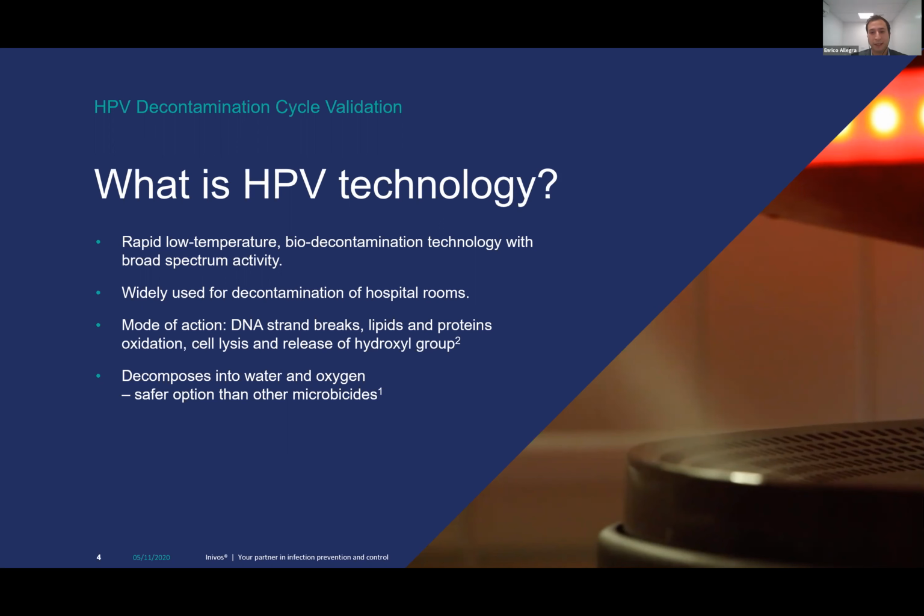I guess a good place to start will be to talk about what is hydrogen peroxide vapor technology. We know that hydrogen peroxide vapor is a relatively rapid biodecontamination technology, and it's mostly produced by vaporization of liquid hydrogen peroxide, which will give a mixture of hydrogen peroxide vapor and water vapor.